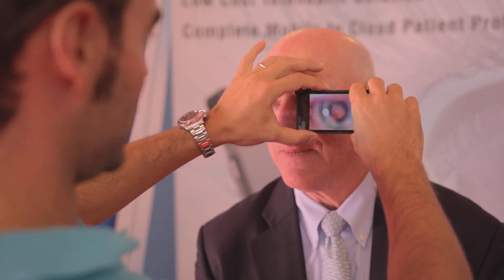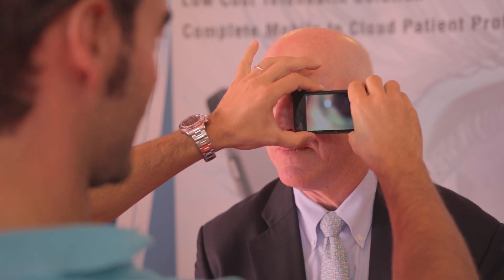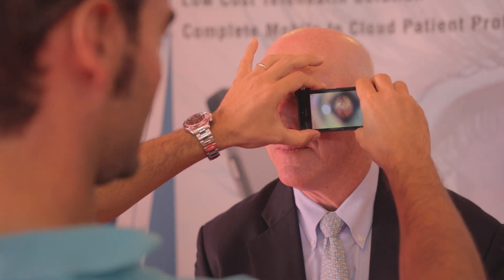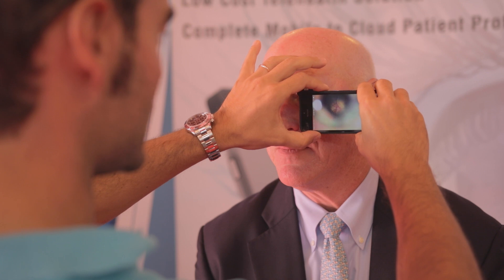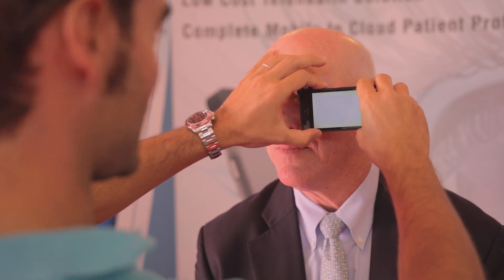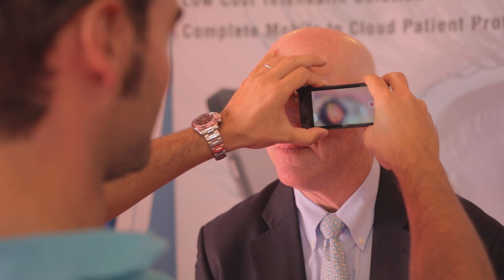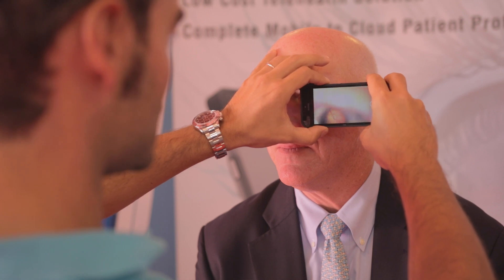It's really easy and straightforward to see the optic disc nerve — it's just one, two, three. You just go near to the eye and you can find the optic nerve head, the vessels, the macula, the fovea. It's really convenient for both the patient and the doctor since you do not need to lean toward the patient, so you can have a safe distance from the eye. You just press here and start recording a video of the retina where you can pan to see all the structures you need.